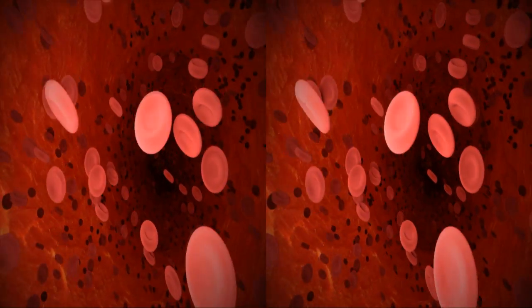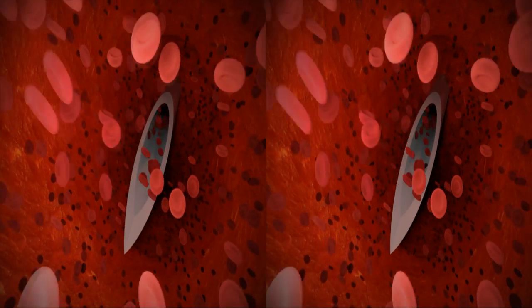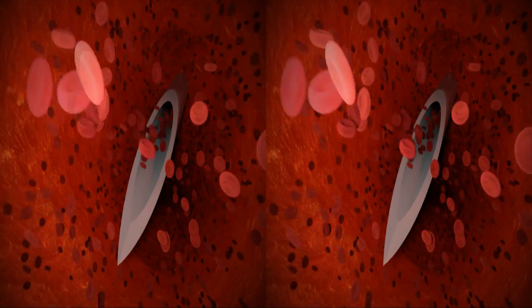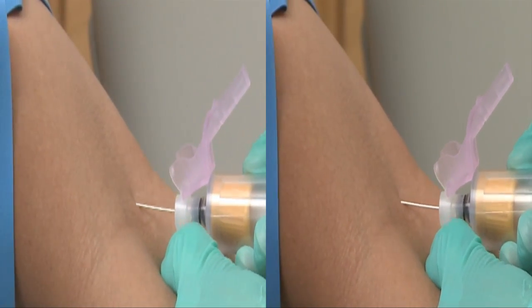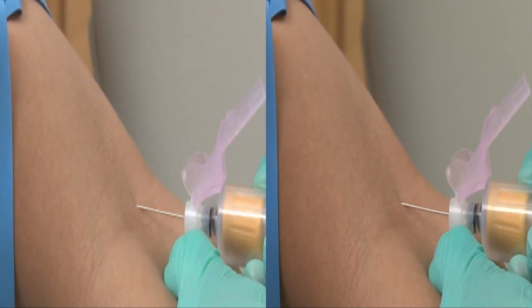As the vein aligns with the needle, blood will begin to move out of the vein up into the needle. Maintain a constant, slight forward pressure on the end of the tube to prevent release of the shut-off valve. As soon as blood begins to flow into the collection tube, instruct the patient to open his hand and remove the tourniquet from his arm.